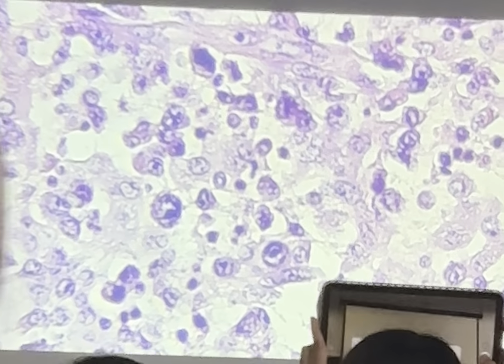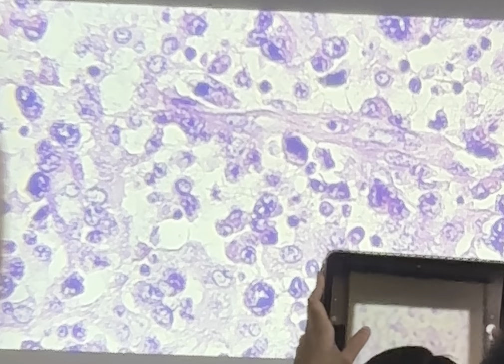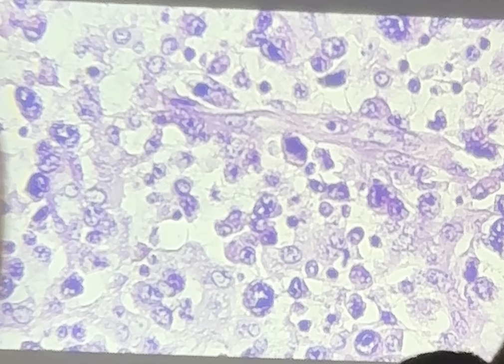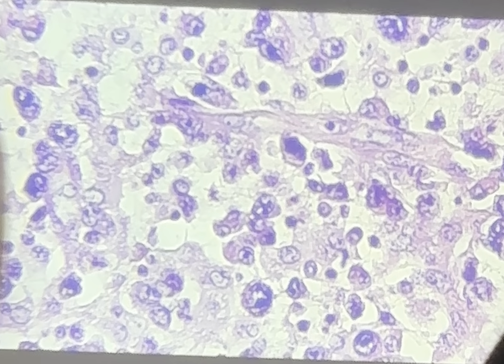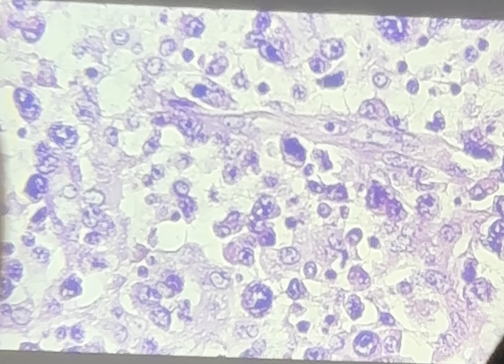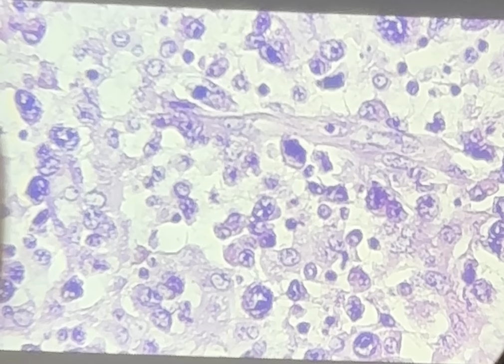Benign or malignant? It's malignant. Well differentiated, poorly differentiated, moderately differentiated, anaplastic? They're not forming any structures. We don't see glands, we don't see papillae, we don't see herringbones. Yeah, this is anaplastic thyroid carcinoma. It's the rarest of the types of thyroid carcinoma, but it is the deadliest. This has a high mortality rate, almost reaching the 90s and 100%.